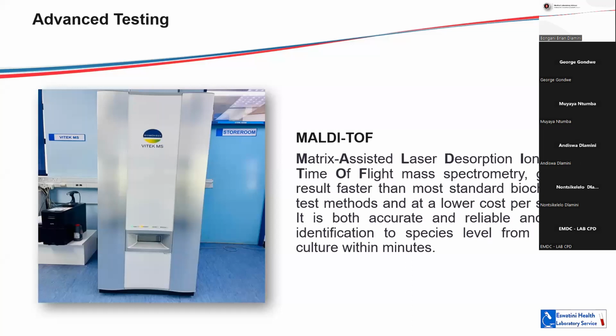So there's an electrical field in that instrument, which then guides the ions into the time of flight mass spectrometer, which separates them according to their mass to charge ratio. And ultimately, the quantity of each ion is measured. So the detection is achieved at the end of the tube. At the top, there's the laser.